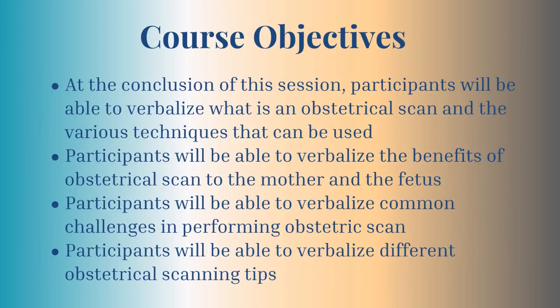Course objectives. At the conclusion of this session, participants will be able to verbalize what an obstetrical scan and the various techniques that can be used are. You'll be able to verbalize the benefits of obstetrical scan to the mother and the fetus, and you'll be able to verbalize common challenges in performing an obstetrics exam and different obstetrical scanning tips.